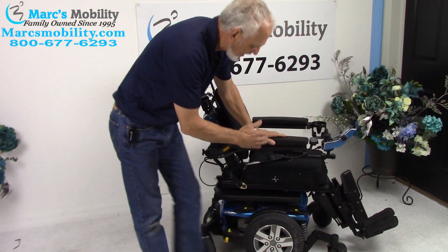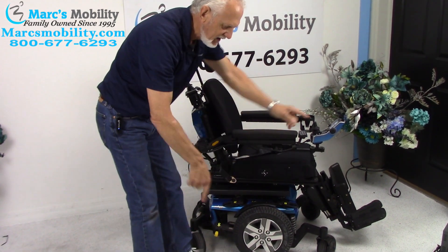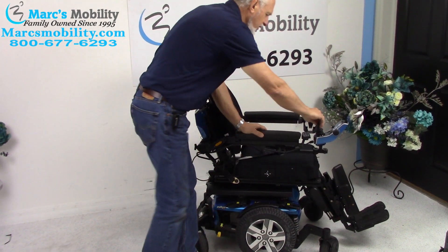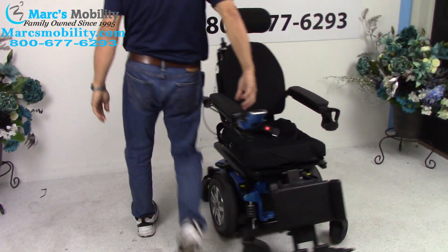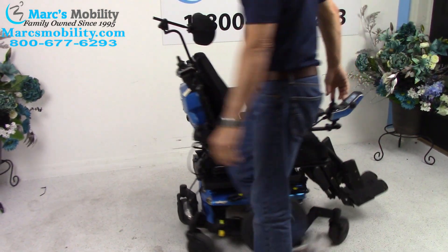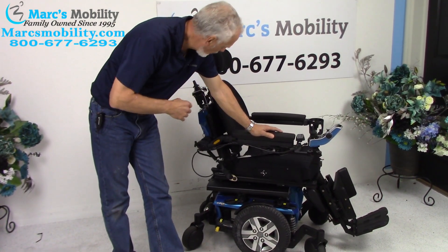This is a mid-wheel drive chair, so your motors are in the middle. That's why you have a wheel in front and a wheel in the back on the ground — that's how it keeps the chair in suspension. It's got a really good turning radius. This chair will turn all day long in your room without moving forward.